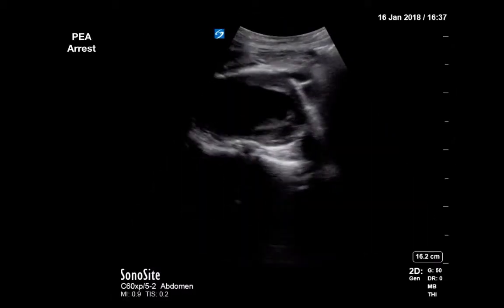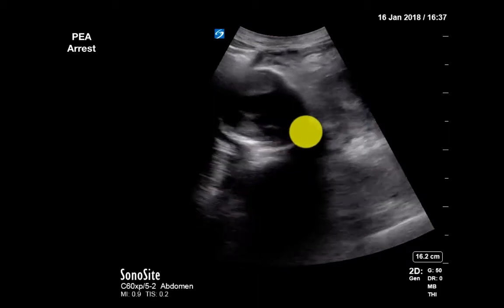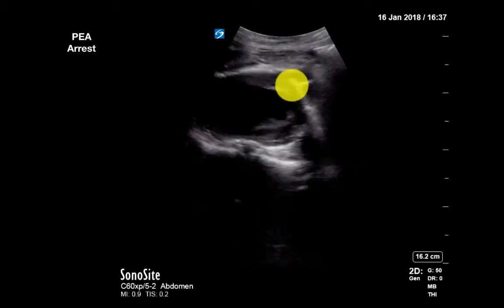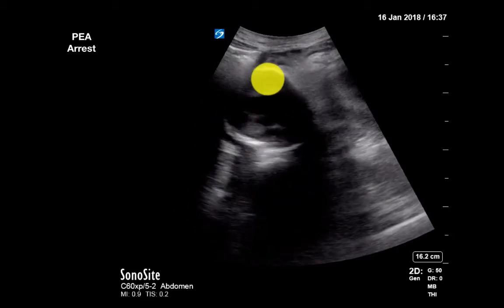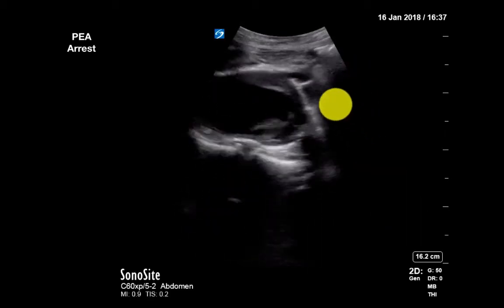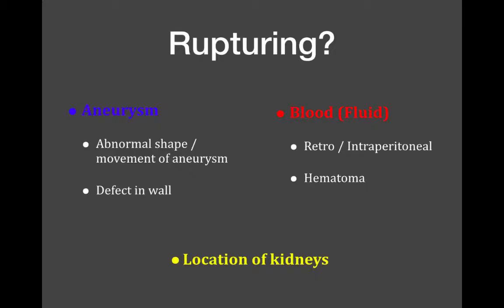Okay. Yet another one. This is one we did about a year ago. This is a really great clip because it really incorporates a lot of the things we talked about. You've got AAA, you've got a break in it, right? This is someone that's in PEA arrest as well, but you've got this huge retroperitoneal hematoma off to the right of our screen, kind of right there. Again, you take those blinders off, you'll start seeing these things. Pretty amazing.